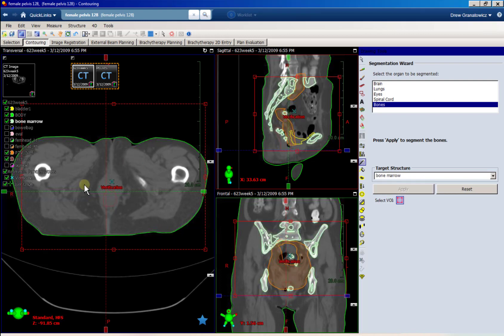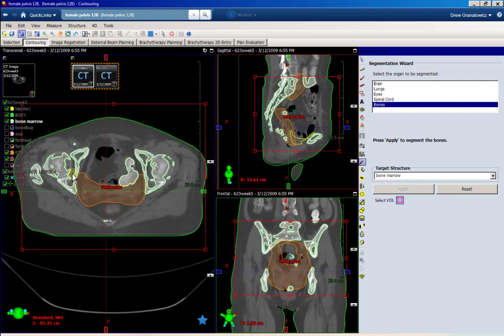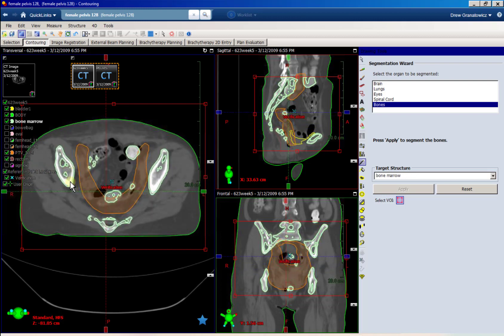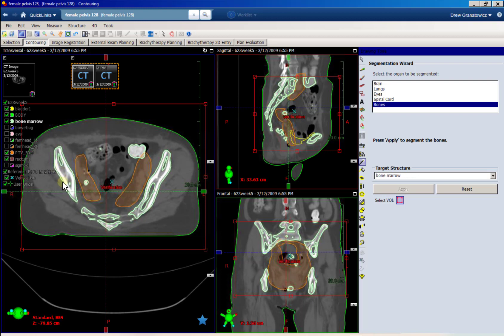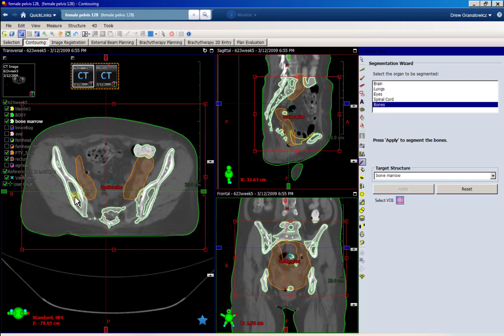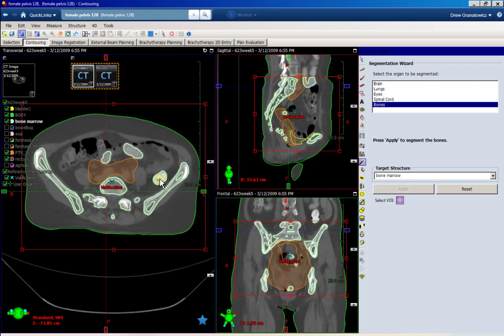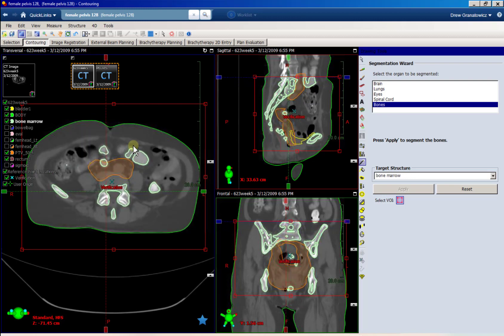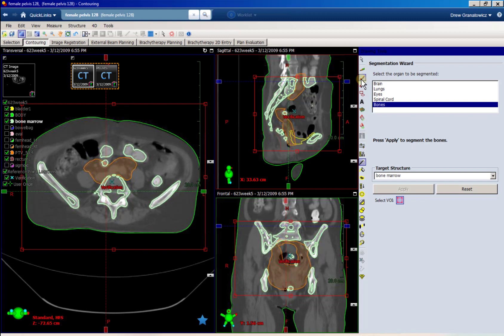Once you have that VOI box set up, you can hit apply. If you look at our contour, you can see it gets bone, which is good. We see all these holes inside the bone — the density is lower there so the tool is not picking that up. But that's actually what we want to have contoured — the bone marrow, the inside of the bones, is what we want to protect. We also need to get rid of these holes. Due to the density, it's also picking up contrast in the bowel, so we want to get rid of that too.